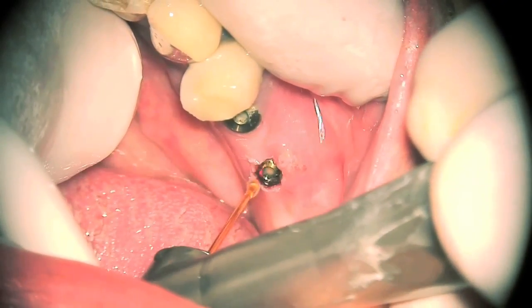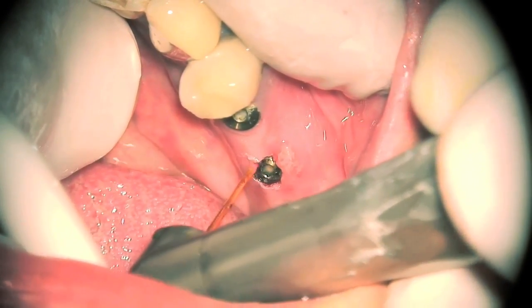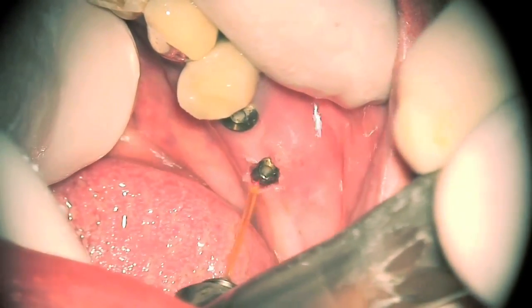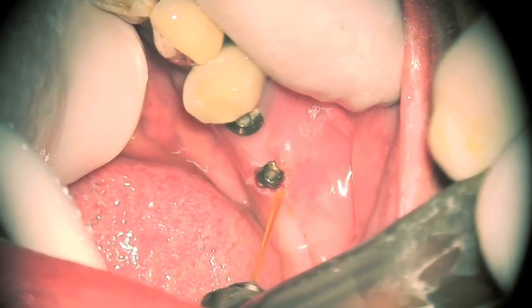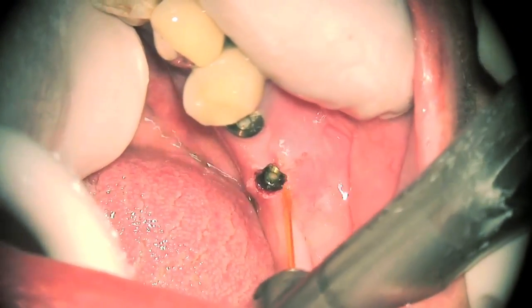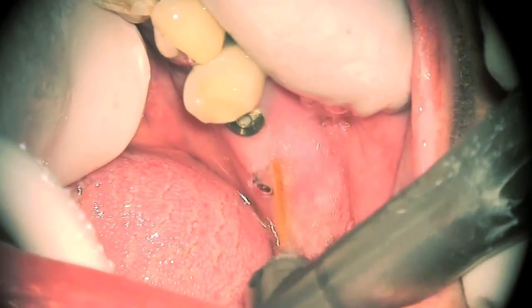The patients have very little to no discomfort after this procedure is done. It can be done only with topical. I rarely use any injectable anesthetic for any of the soft tissue procedures that I do.